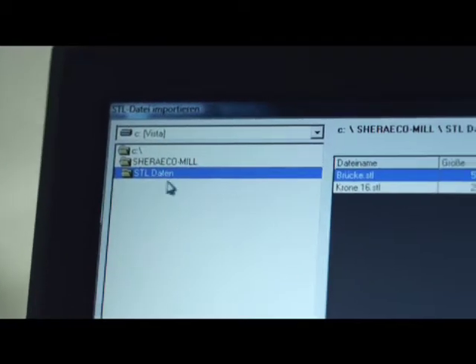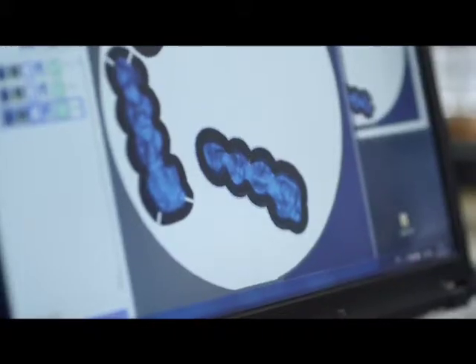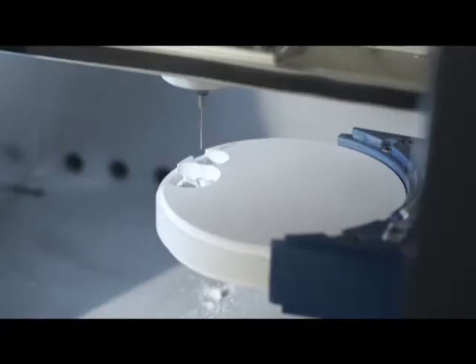It is already profitable to work with the Shera EcoMill 40 from only a few milling units per month. That is why the small, high-tech milling machine is the economic alternative to a big milling center.